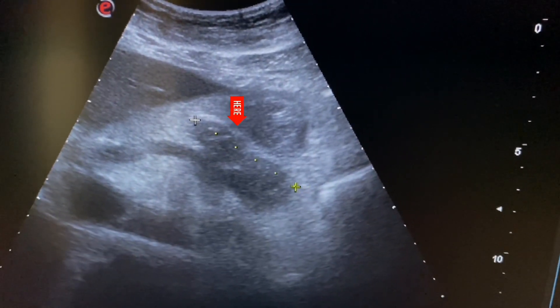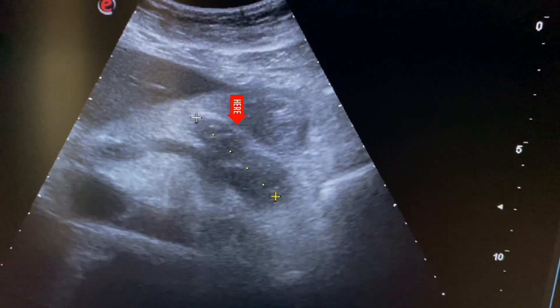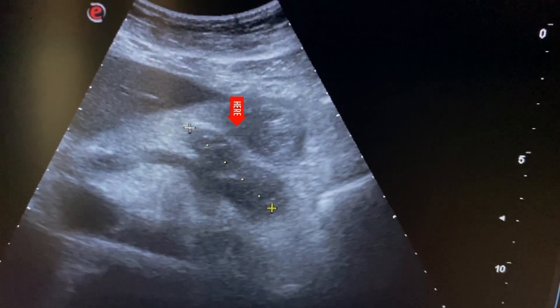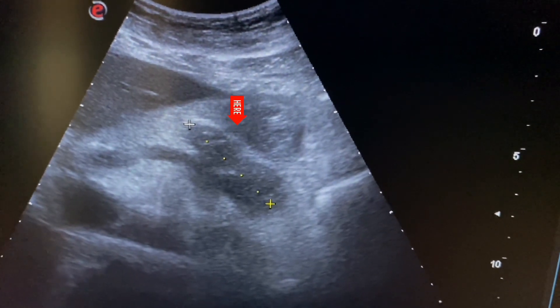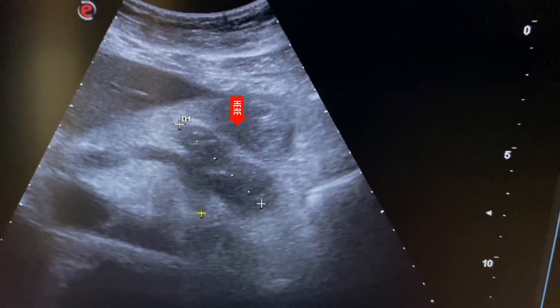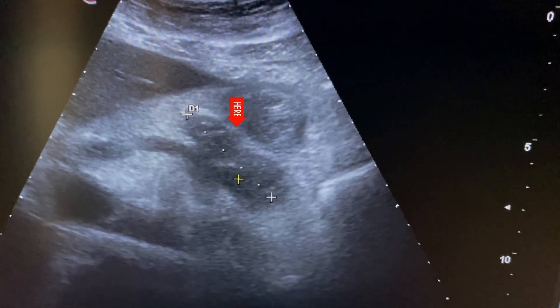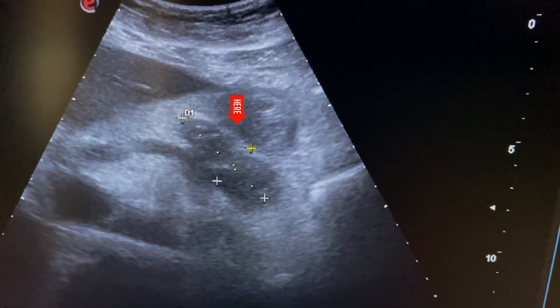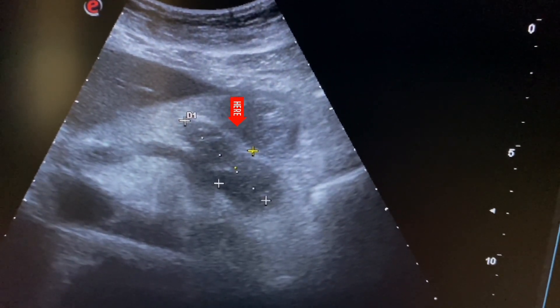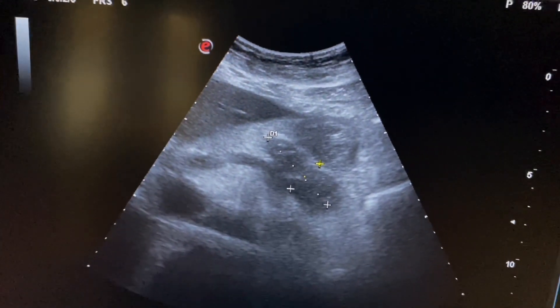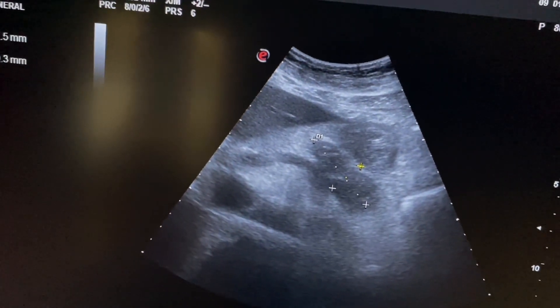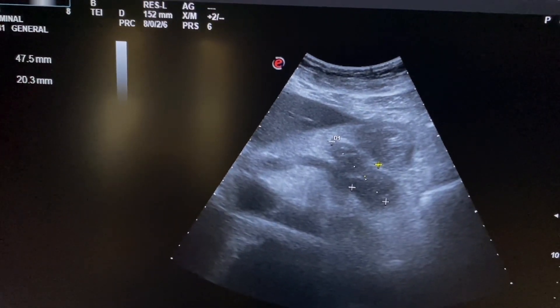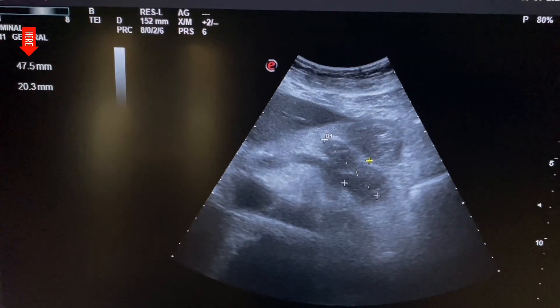Here we measure the heterogeneous area of the body and tail of the pancreas. The heterogeneous area measures 47 by 20 millimeters.